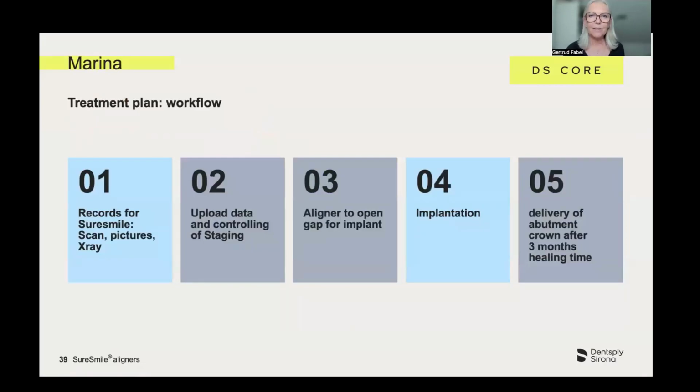Yeah, and this is the treatment plan and the workflow in those cases. We start the records, upload the data, control everything, wear the aligners to open the gap for the implant placement. Then the implantation takes place, and after a couple of months, it took us quite a while to open the gap. Yeah, I'm about to deliver the abutment in the next days.